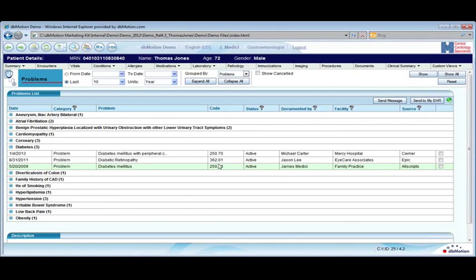We can allow the clients, not at the end user level, but on a hospital or a group level during implementation, to customize that grouping and a lot of the vocabulary mapping as well. Some very small clients say, we'll take everything out of the box, and I think that's the move for almost everybody. Really huge clients say we have our own specialized needs and we want to group things in our own localized terms, and we can certainly help with that as well.